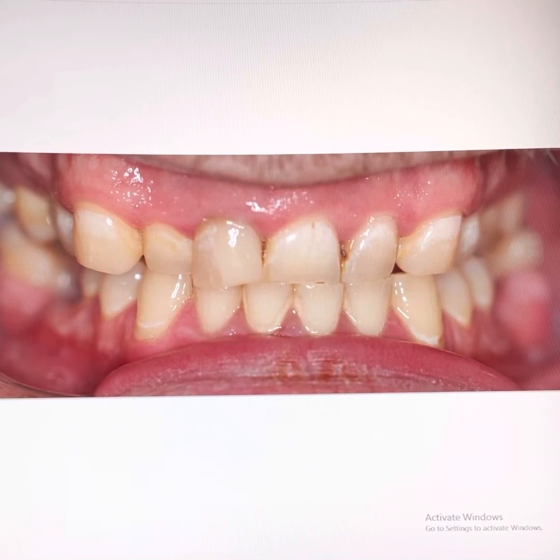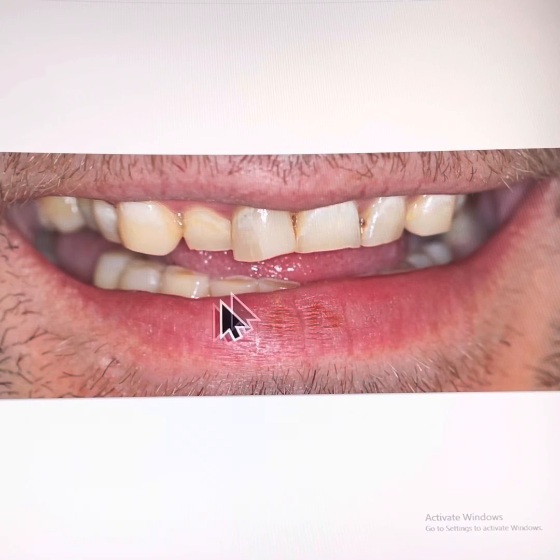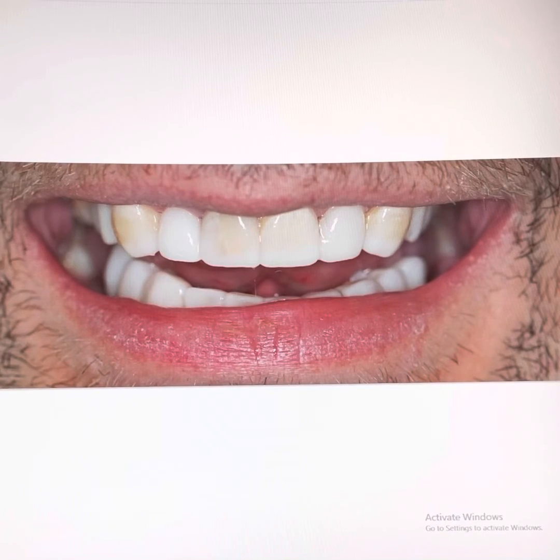To do a smile makeover, we need to increase the height of his teeth occlusally, thereby increasing the height of his bite. We perform a smile design and smile try-in with temporary composite material, making sure that the patient is happy with the design.